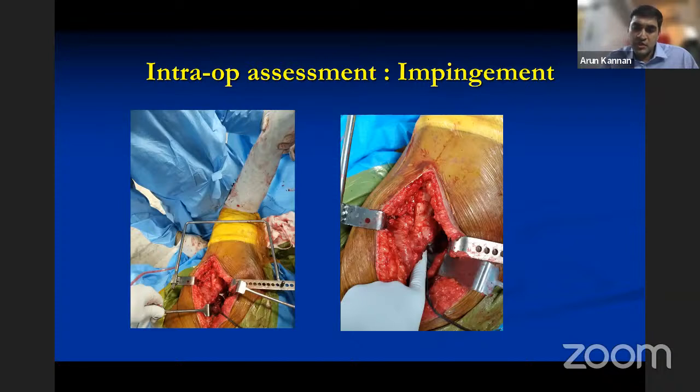So with this approach, if it is a version problem, increasing the offset won't help. And if it is a bone against bone impingement where the GT is sitting against the pelvis, changing the acetabular version won't help. I think those are the points I wanted to highlight here. So we have to find where it is impinging and correct accordingly. If it is component impingement, then version needs to be changed. And once you've got all this in place, acetabular version can still be changed. It takes effort, but that's what would require a change. But if it is external impingement, then just increase the length and we'll get the impingement-free range of movement.